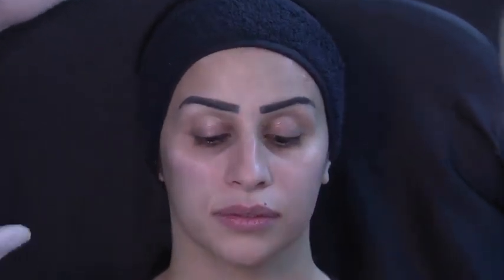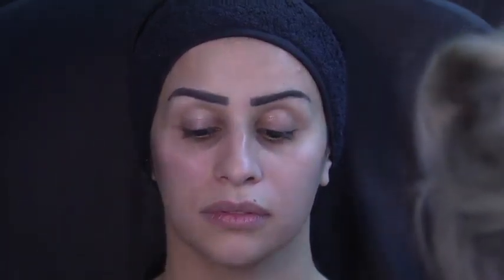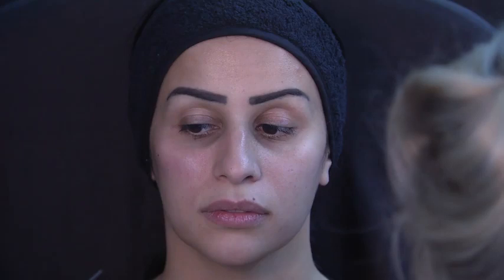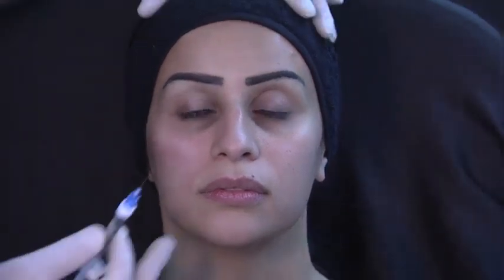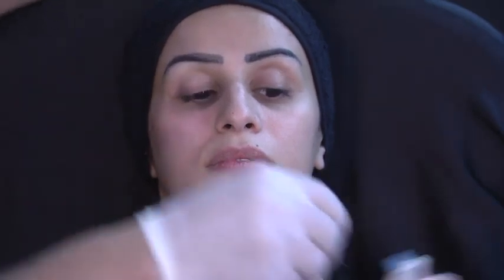Remember, Vital Light is 100% cross-linked, still a NASHA technology, so it still has lifting capacity for this thin skin. But at the same time, it's the only product with a concentration of 12 milligrams per milliliter. We can talk about this later in a discussion, but I've been trying to find the best product for the tear trough for years, and I finally realized that this is 100% cross-linked, and it was only 12 milligrams per milliliter. In this case, I'm going to use a cannula, 27G cannula.